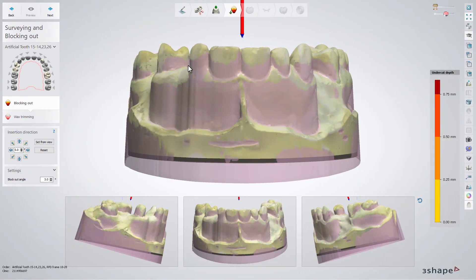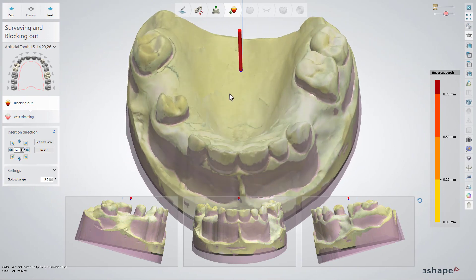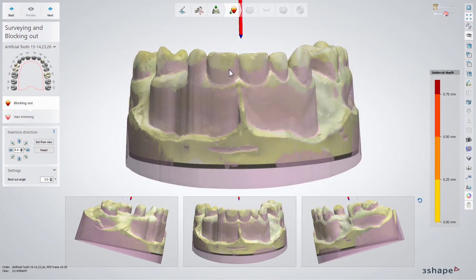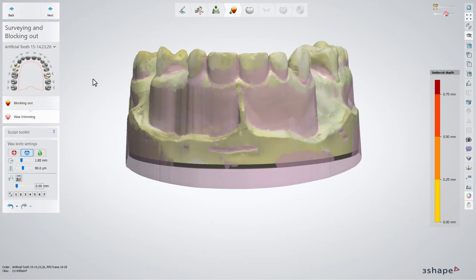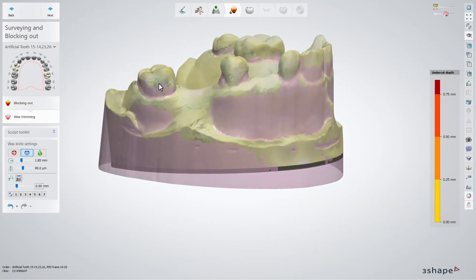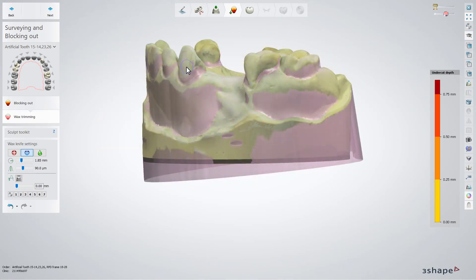In the surveying and blocking out step, analyze the model and set the correct insertion direction. Prepare the space for the clasps, use the wax knife and remove unnecessary material. Click Next.